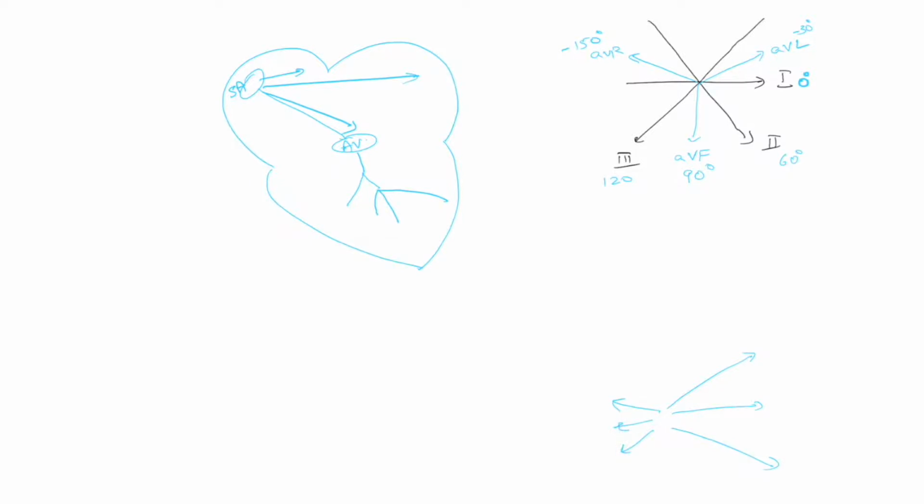Now, there are multiple vectors all over, but if you were to add them up, you would end up with only one vector that looks something like so. If you were to have a negative electrode and a positive electrode, all this would be summed up into pretty much one wave that looks like that. So all these six vectors would transcribe into one positive deflection.